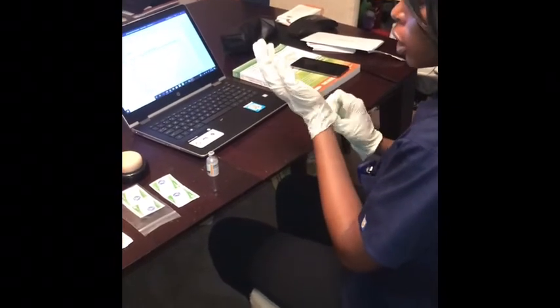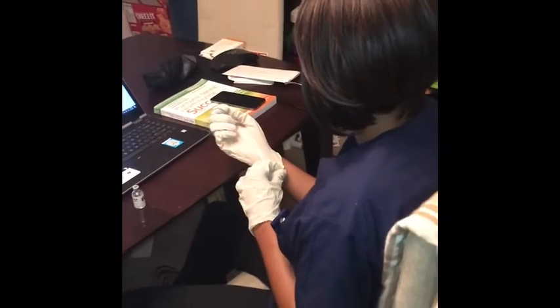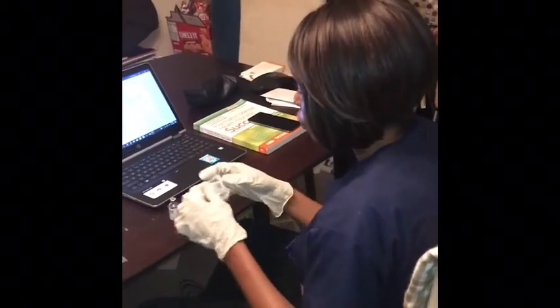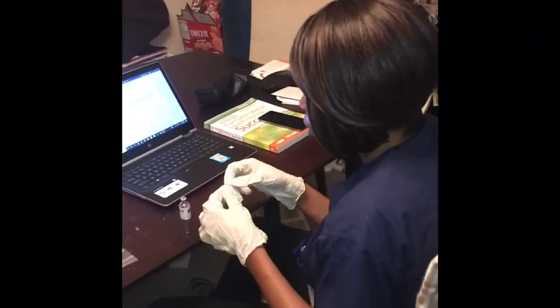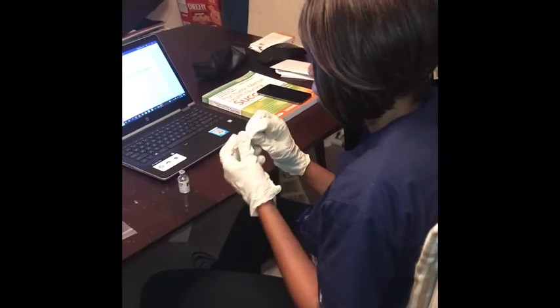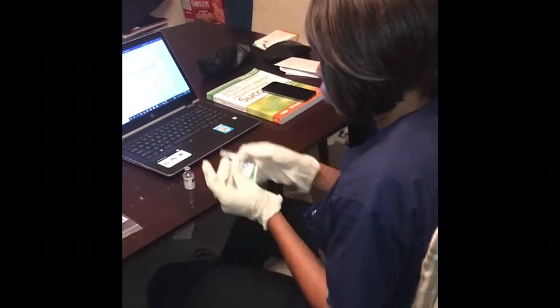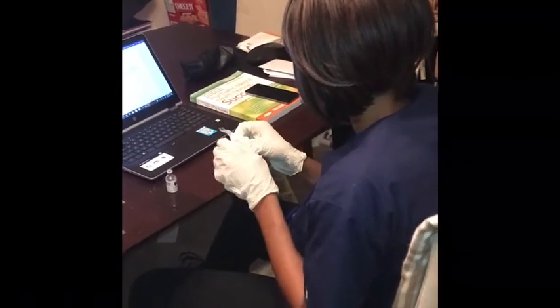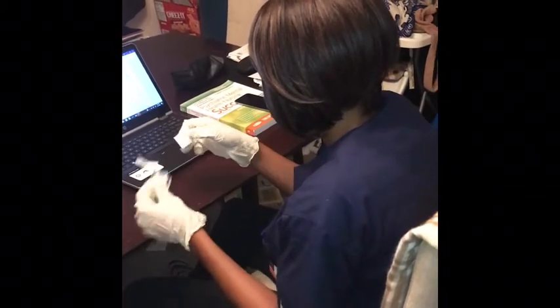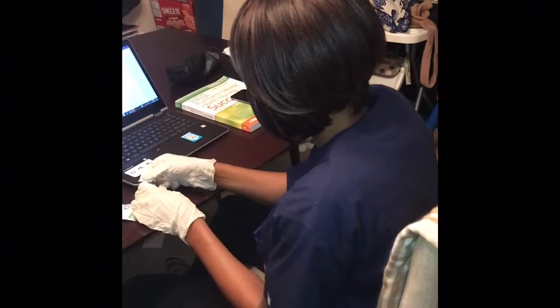I make sure everything is sterile. I'm going to use alcohol to clean off the top. I take the top off. I do it for 15 seconds.